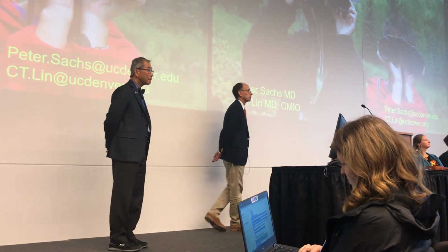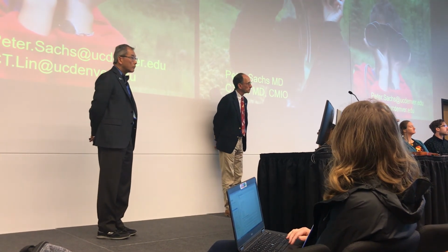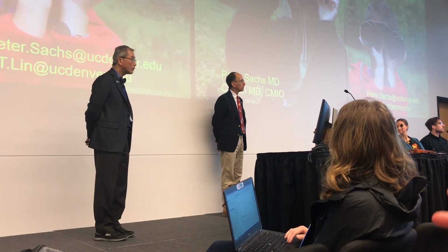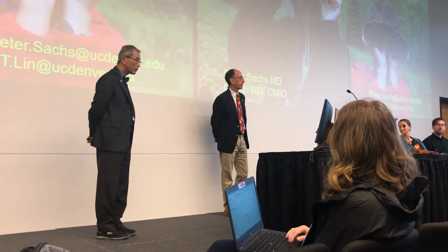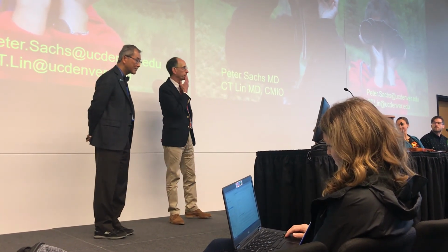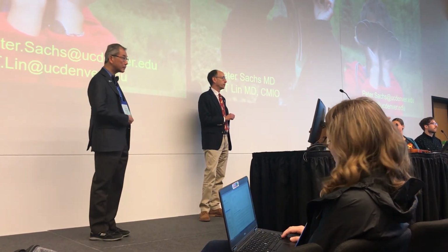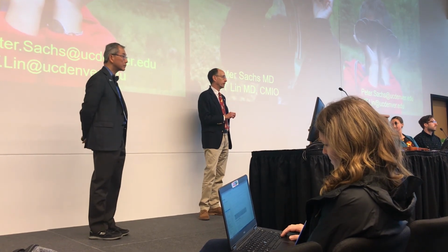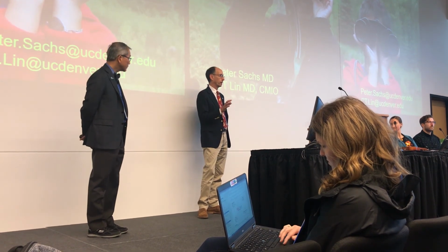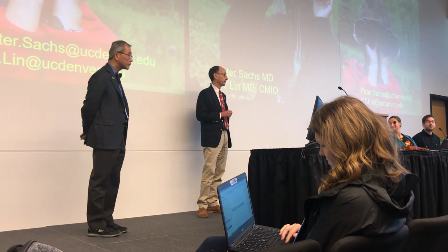Kelly with Integris. Any pushback from cardiology in that the general public might see all imaging as one, and hey, I can see my x-rays, but I can't see my echocardiogram because cardiology hasn't done it? Funny you should ask that. Cardiology images are viewable on our timeline. So we've merged into a single viewer. So all the cardiology images are there. The reports are not there. We haven't enabled that anyway. We've disabled the report viewing, but they can see the images.